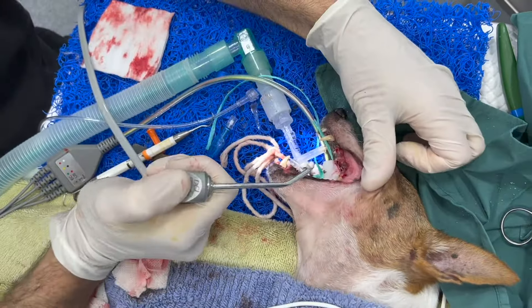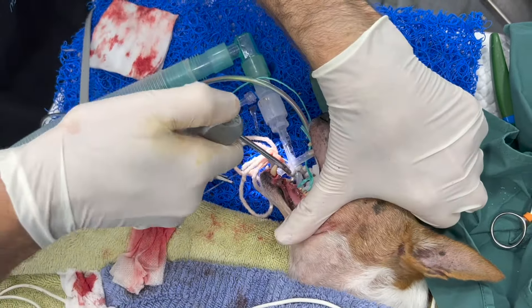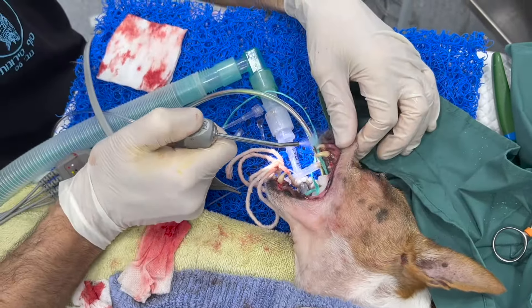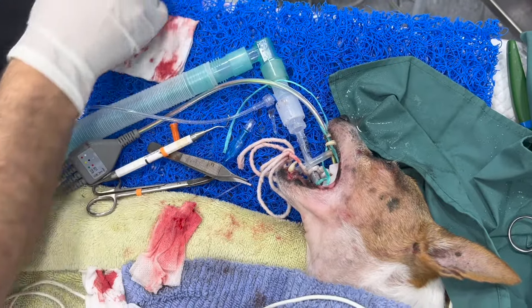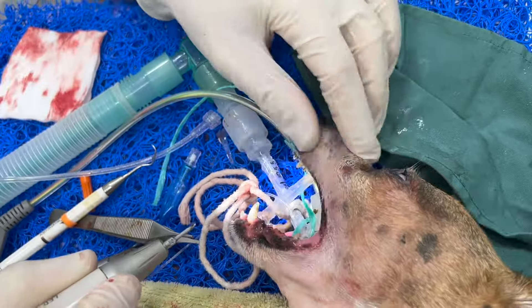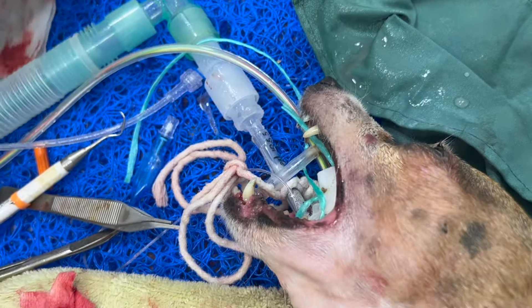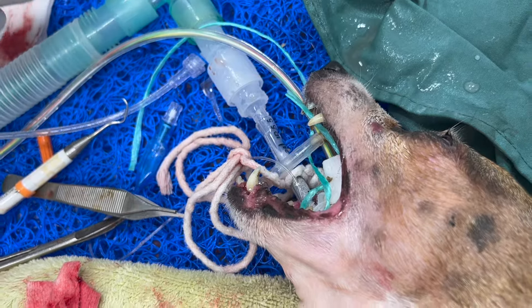Now that we've cleaned a little bit under the gums, I'm going to rinse under the gums as well. With limited time, I'm going to finish scaling and polish this side, then we'll do the other side.